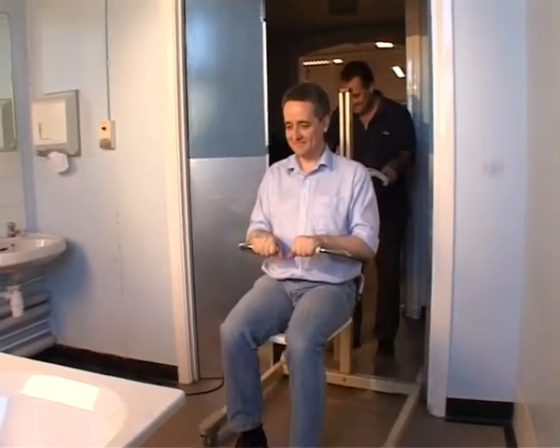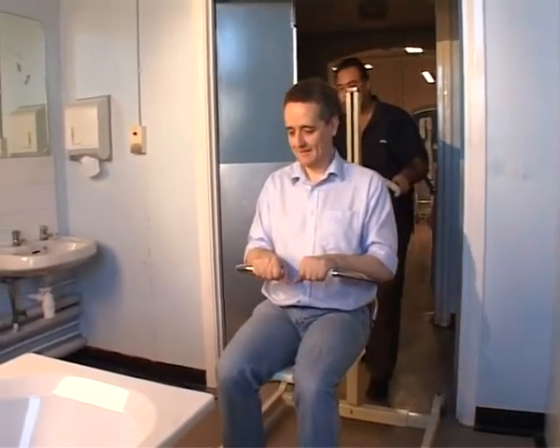My name is Ersen. I'm a clinical technologist for the Medical Physics Department at the Whittington Hospital in North London. My job entails dealing with all equipment in a hospital that doctors and nurses use, which is attached to patients indirectly or directly. My job is to service, calibrate, look after, assess, maybe even purchasing, and looking at new research and all medical equipment.